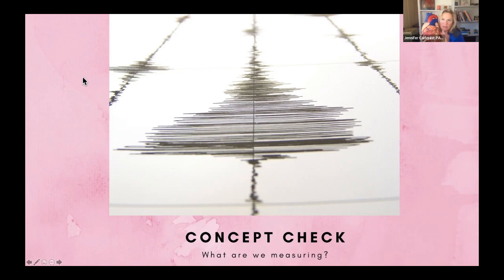Okay, now this guy, this is the way I like to think of it. He sends signals from inside our chest. Basically, the electrical signals are what we capture on the 12 lead. We also capture these on our rhythm strip. When we're looking at a 12 lead, we're looking at the front of the heart, but in the rhythm strip, we're just looking at the electrical activity. So the question that we're always trying to answer is, did the sinus node still remain in control of the heart, right?